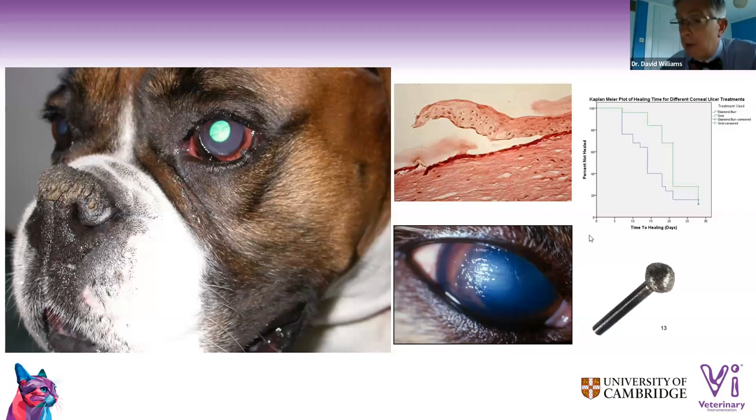But actually these days, I must admit, the diamond burr works really well. Oh, Paul, phenol cautery. Yeah, we'll get to that in a moment or two.